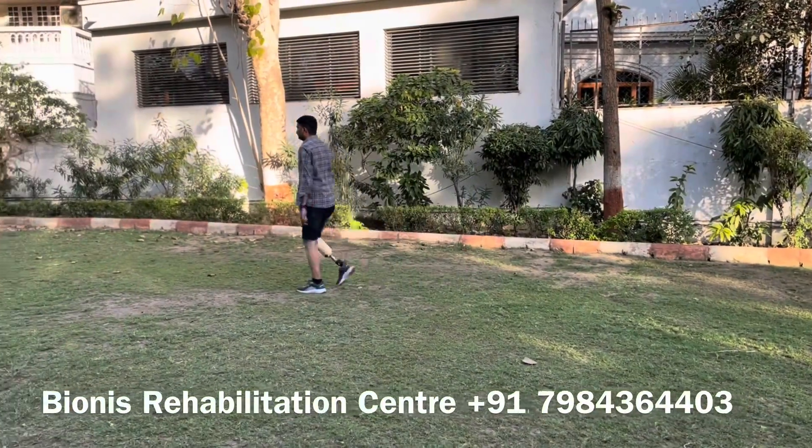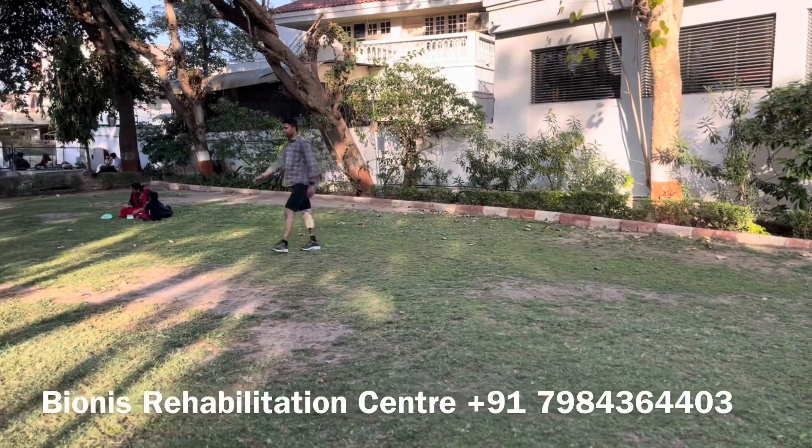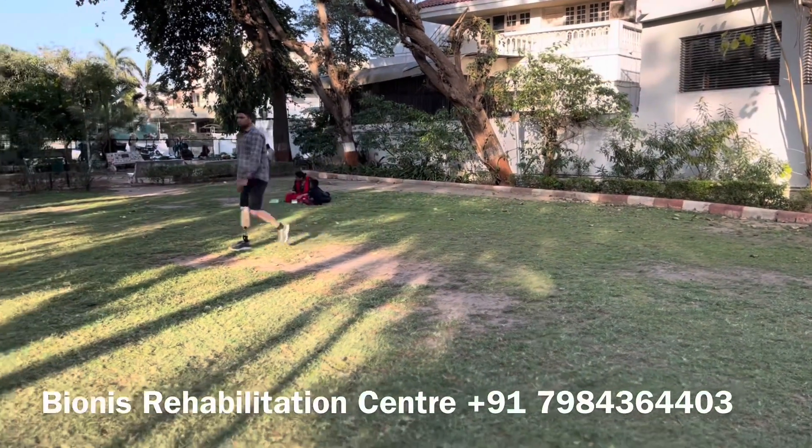Putting the prosthetic leg on and removing the same will take only 10 to 15 seconds, which reduces time in your daily active lifestyle.